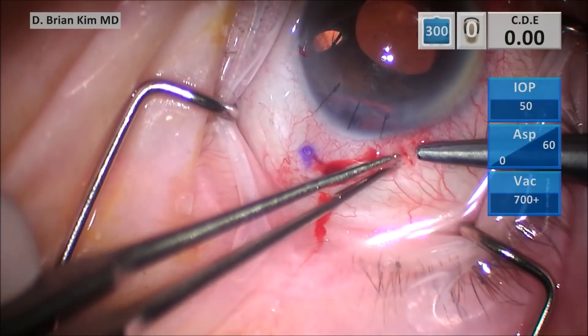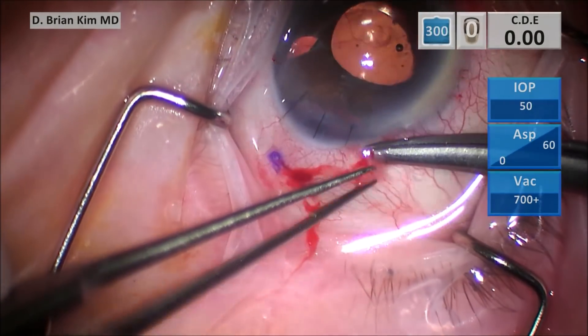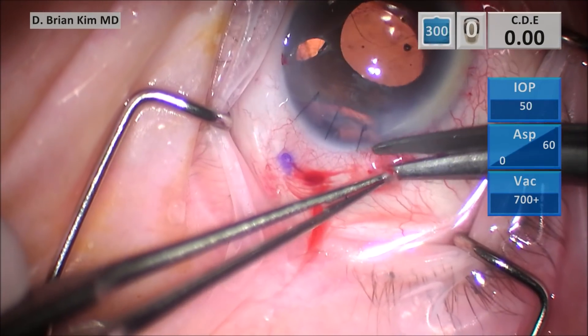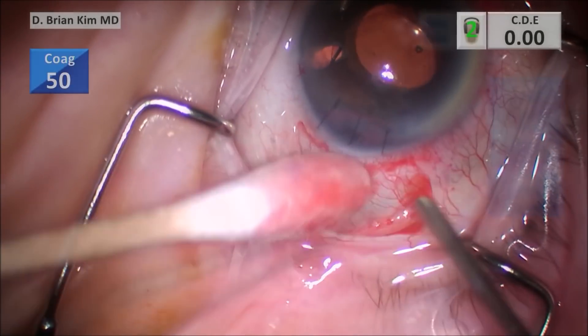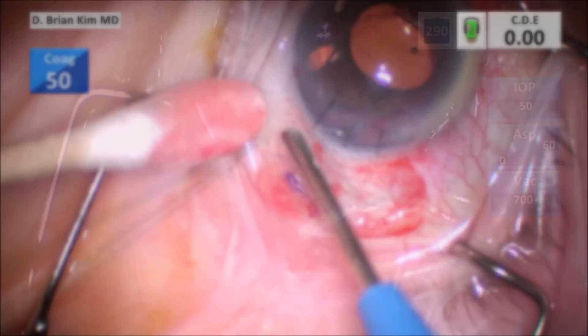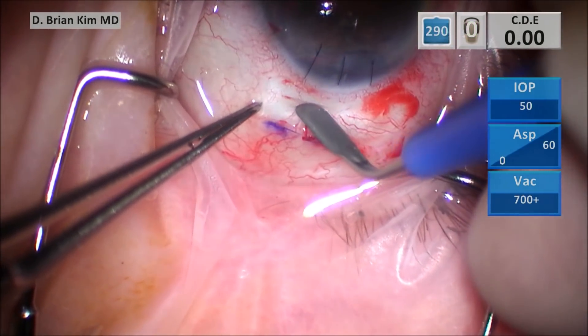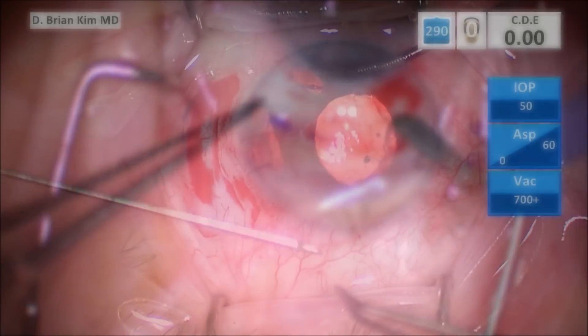A temporal peritomy is performed. Attention is drawn to the iridodialysis, which we're going to repair using the sewing machine technique. After the peritomy, cautery is used for hemostasis. Then a partial thickness scleral groove is created approximately 1.5 millimeters posterior to the limbus.